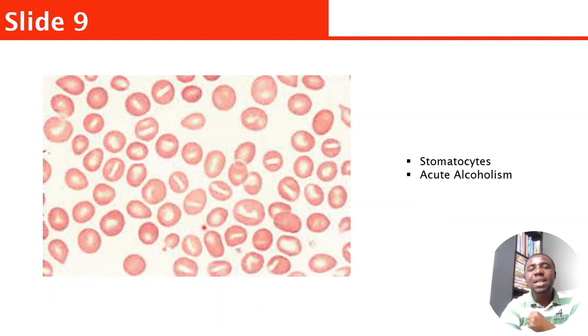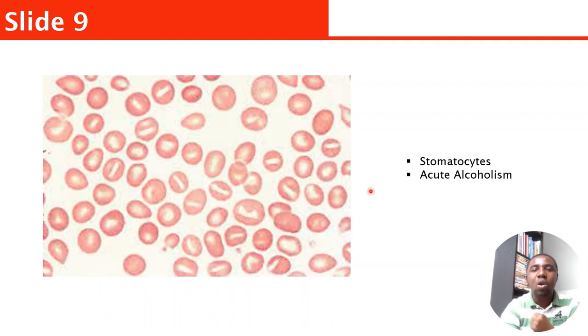This one is called stomatocyte. When you see the red cell with a middle line through it, that is called a stomatocyte, and it is common in acute alcoholism.